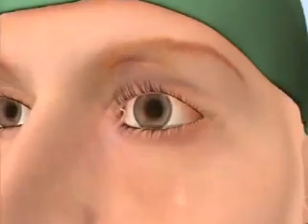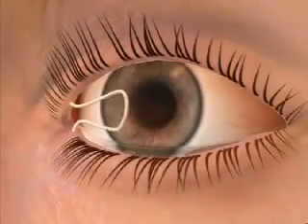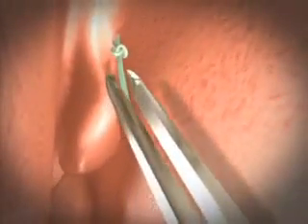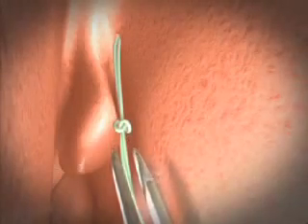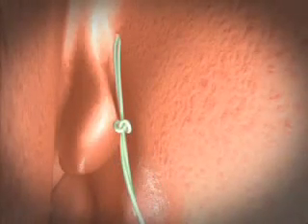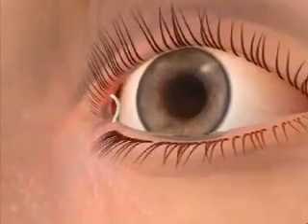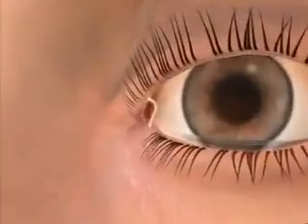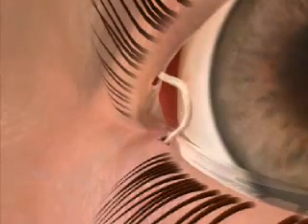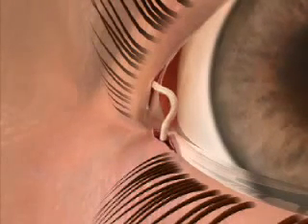Another complication we describe is lateral displacement of intubation. This can be easily resolved with the endoscope and is relatively unimportant if the tubing is withdrawn early and periodical washing is performed. We suggest early withdrawal of intubation at 3 weeks to prevent granulomas and duct laceration, and to obtain the best possible outcome.